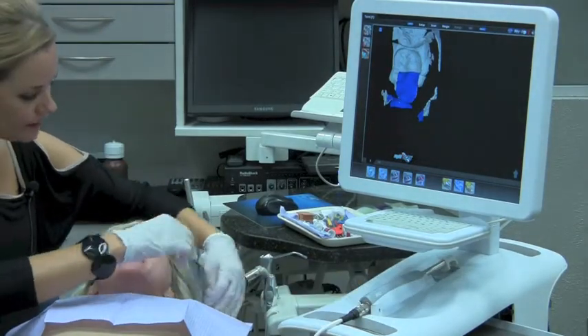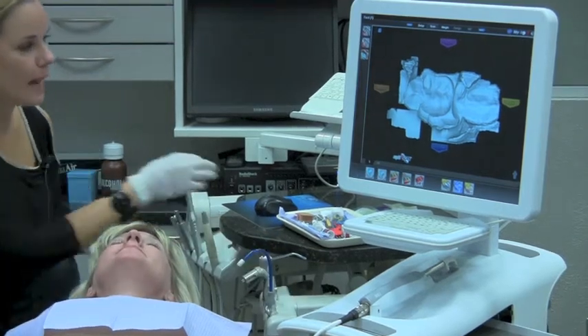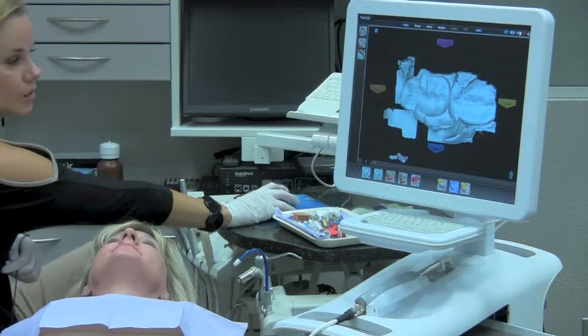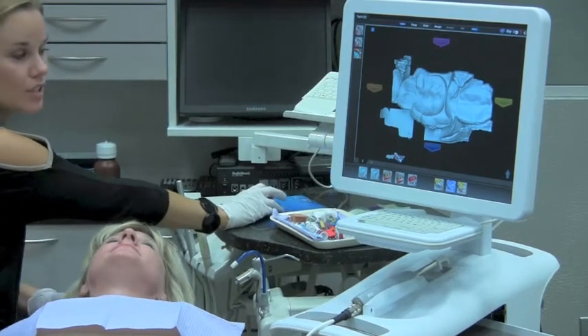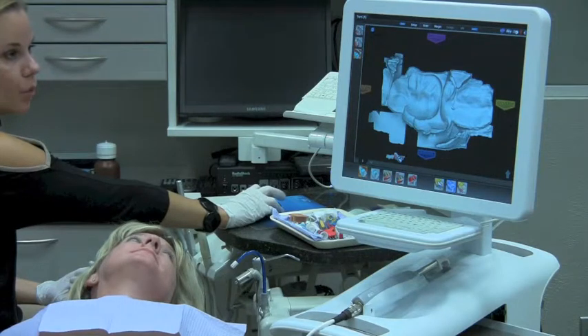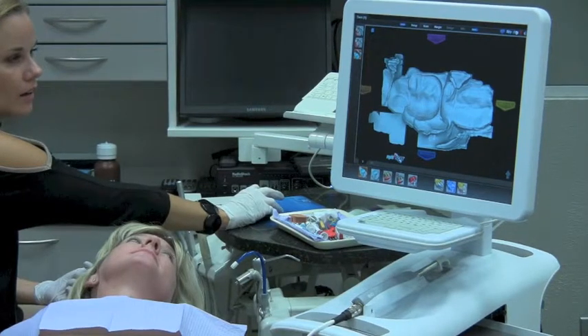I'll go ahead and take all this out and give Terry a break. What you can see here is we've been able to capture the distal neighbor and the mesial neighbor and the common data, which is the bite registration. I'm going to tell the system what part of the bite is important to me by selecting that surface of the impression.